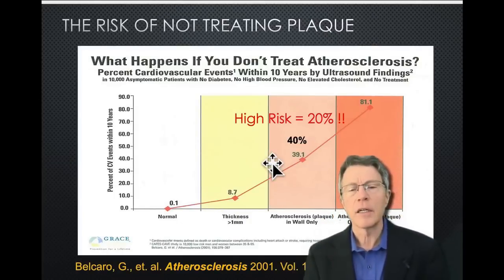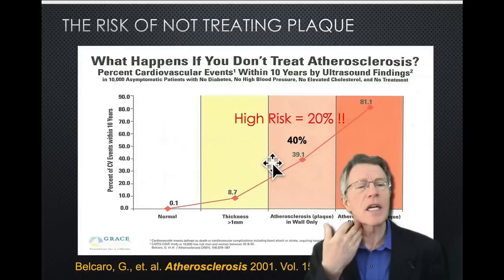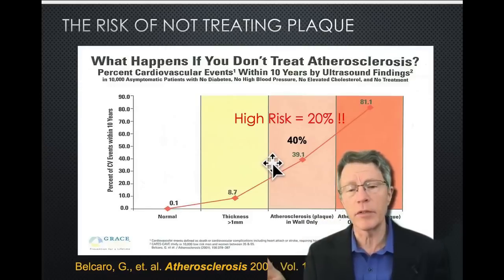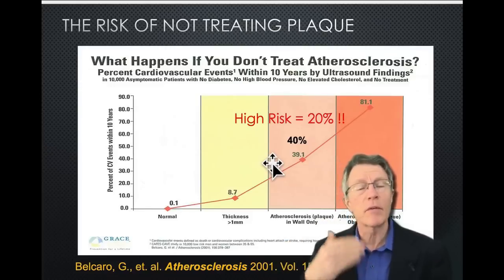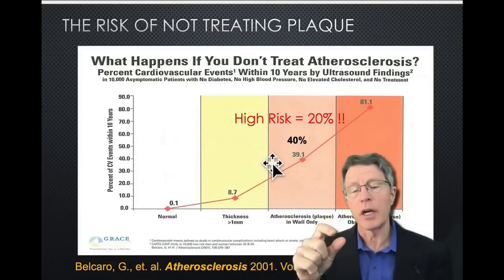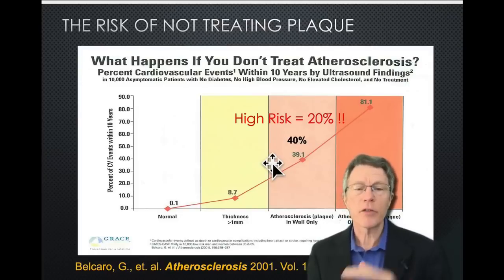It's the ultimate study which demonstrated that, look, if you get CIMT, in other words, take that ultrasound of the carotid artery, it's the same ultrasound that all of them are doing. However, it requires that you get a very good technique on the common artery and get averages of the size of the plaque. Now, why is that helpful? Here's why it's helpful, and here's what we mean by risk stratification.